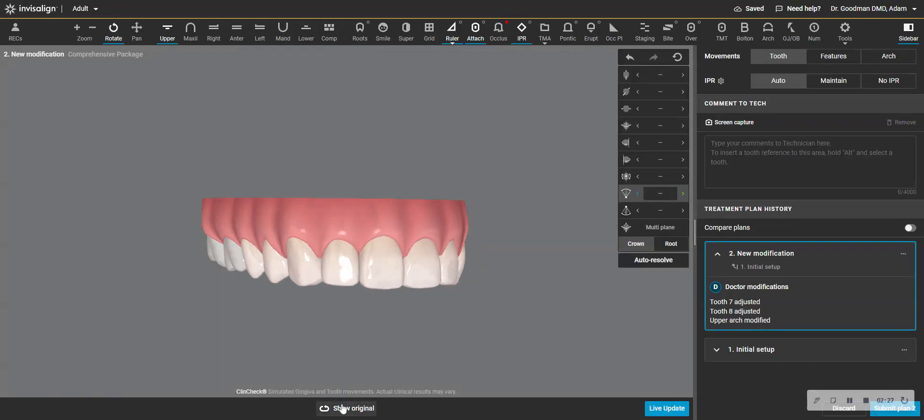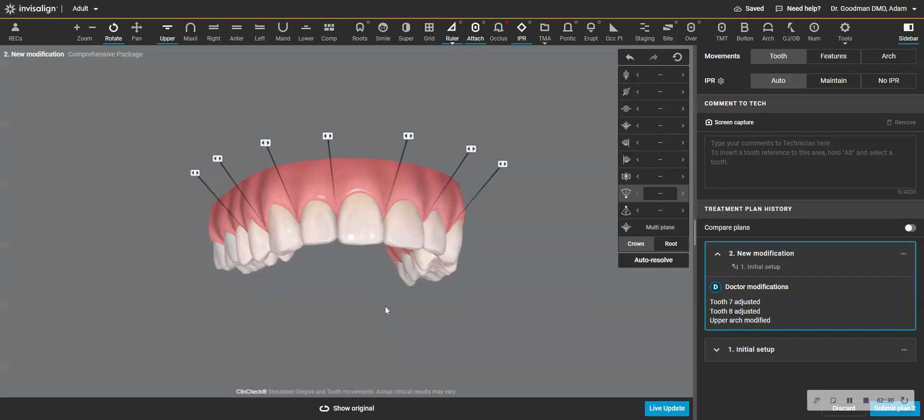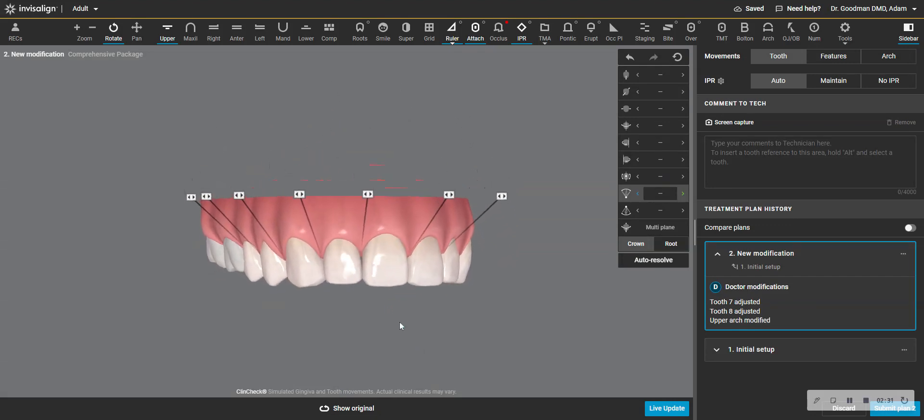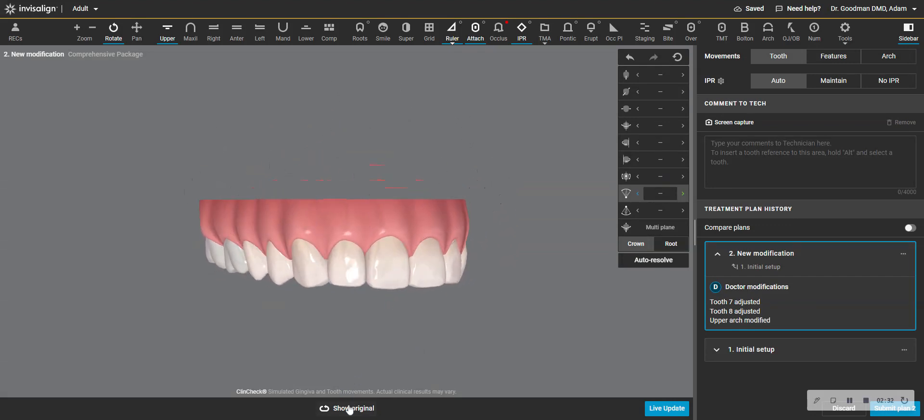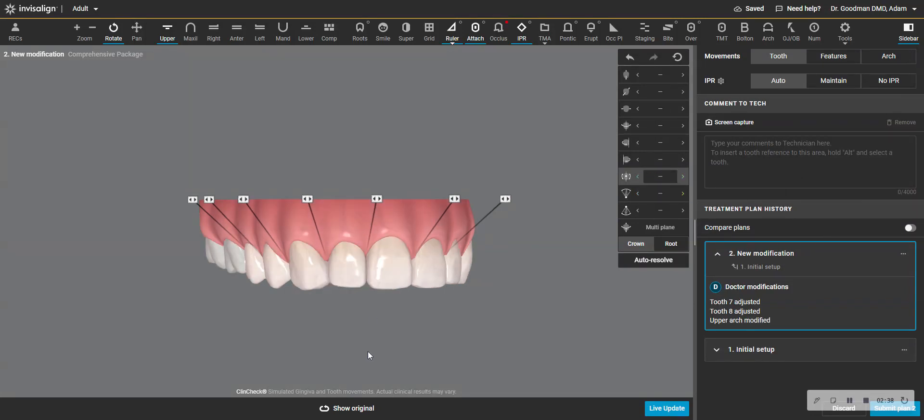So that's how the tooth is. That's how it's ending up. But I don't want the dark triangle and I'm fine leaving that root like it is. So I take this, go here, keep it the way it is.